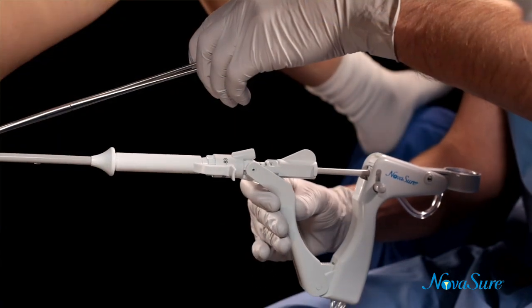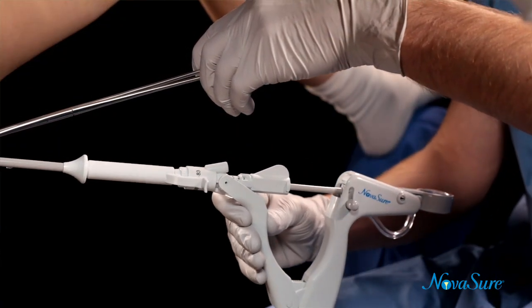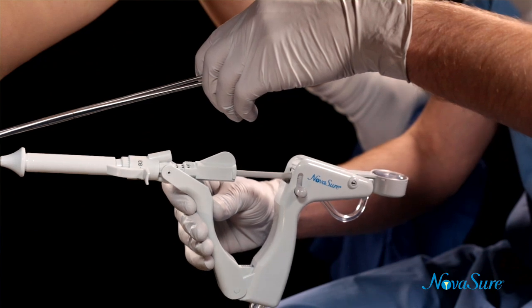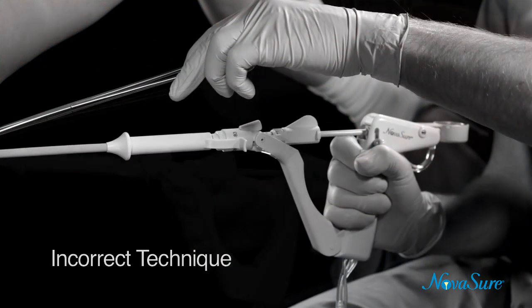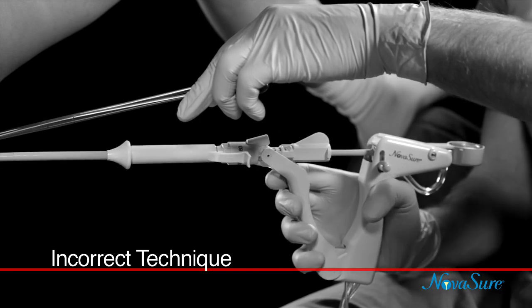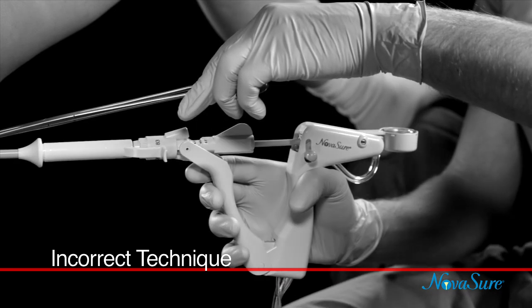Holding the front handle, gently insert the device transcervically in line with the axis of the uterus until the distal tip reaches the fundus. An example of incorrect technique would be holding the back handle or both handles during transcervical insertion of the device.